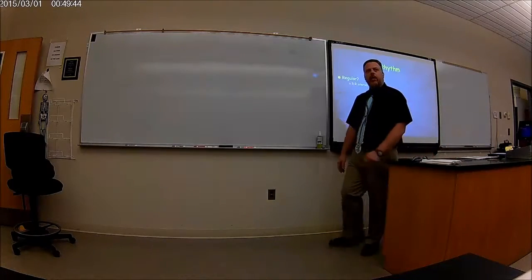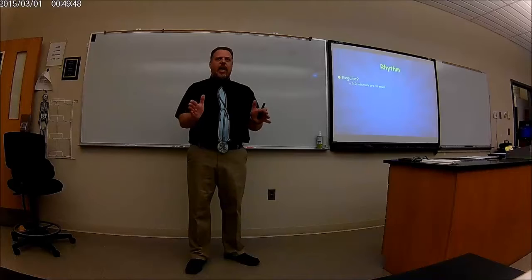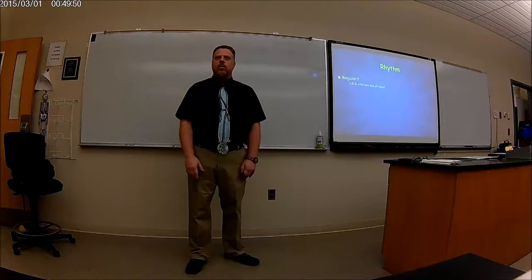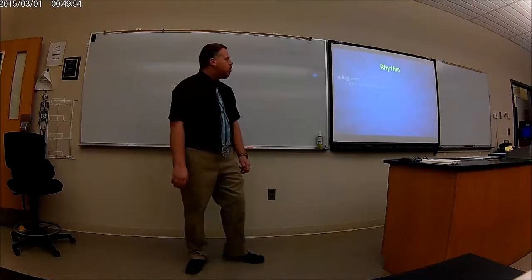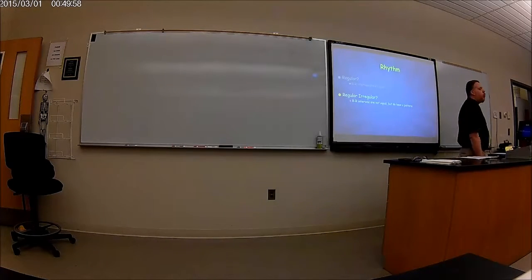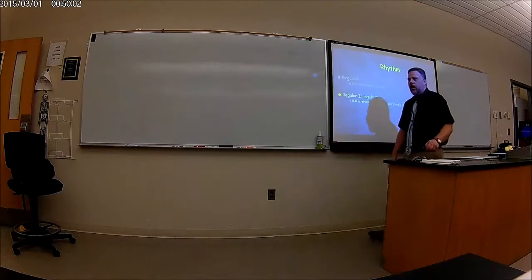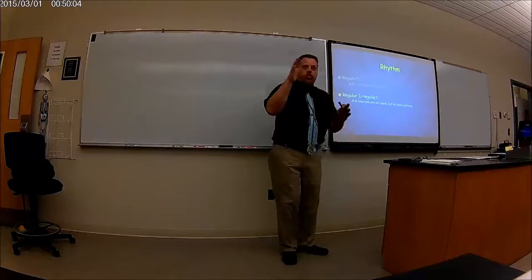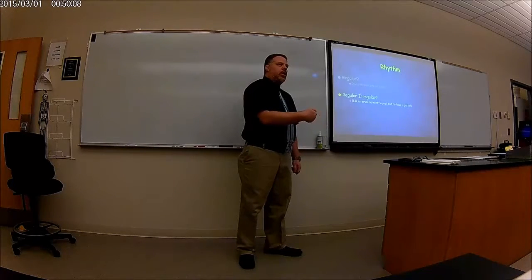Rhythm. Is it regular? Are the RR intervals the same in between? The same space, the same number of blocks in between? We could have regular, irregular, meaning that it's irregular, but there's a pattern with it.